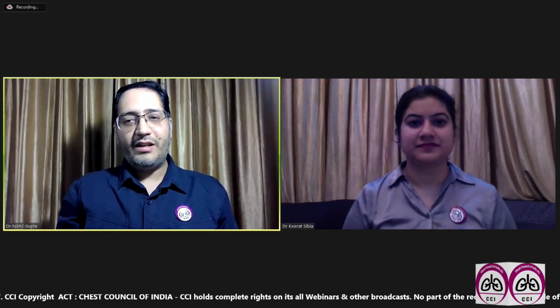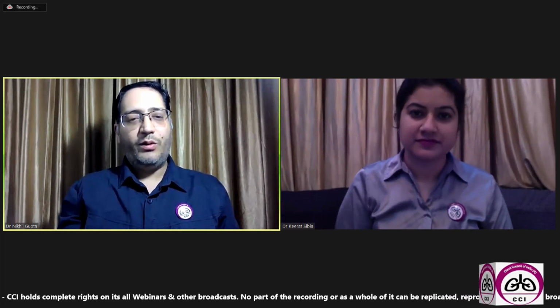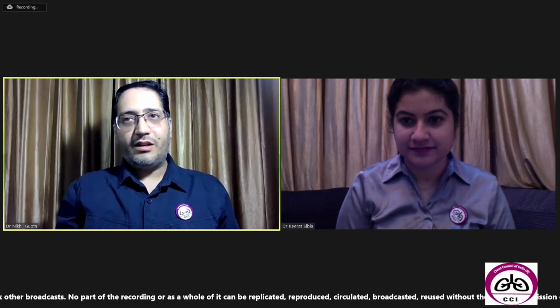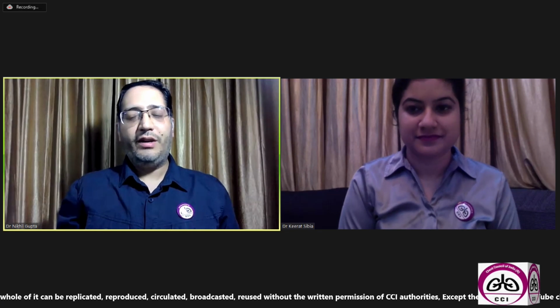Silhouette sign is the loss of interface when two similar densities come in contact with each other. A consolidation or a mass which has similar density to the mediastinum or soft tissues of the abdomen forms this silhouette sign. For example, if there is a mass or a consolidation in the basal segments and the hemidiaphragms are hidden, we can be conclusive that there is something wrong in the basal segments.